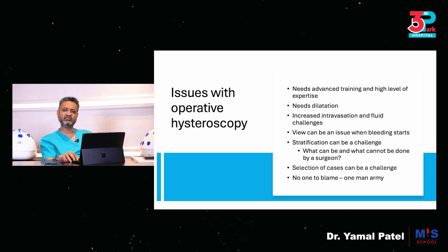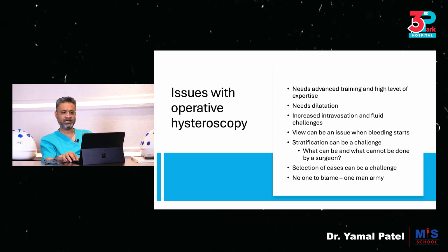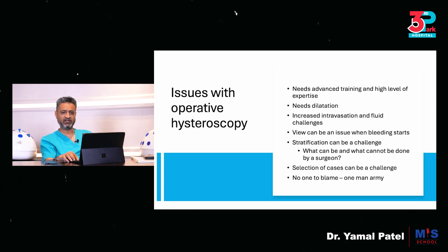There is increased risk of intravasation and fluid challenges. The view can be an issue when bleeding starts, so we have to make sure that that is taken care of as we're operating, and it's not going to disrupt our procedure. Stratification can be a challenge, which means what can be and cannot be done by a specific surgeon is very difficult to stratify and to guide.